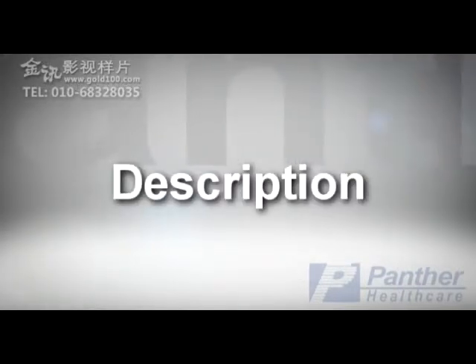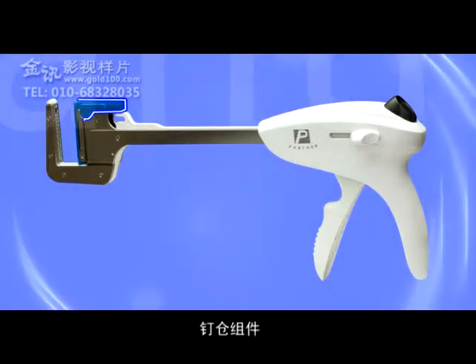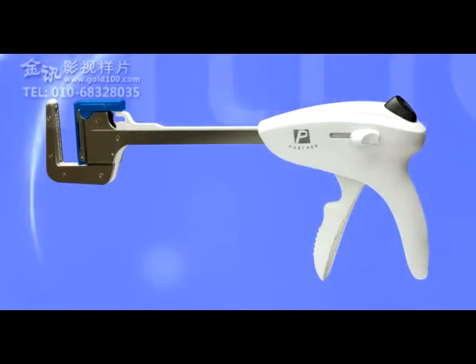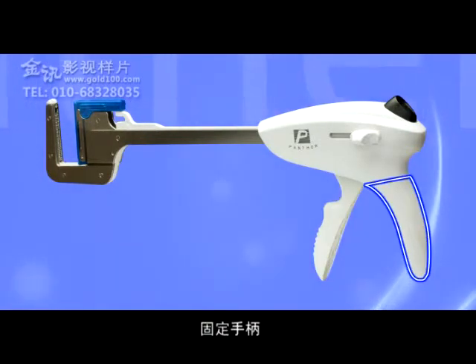Description: Looking at this instrument, begin at the distal end of the PANTHER linear stapler. Here is the anvil and reloading unit. The retaining pin must be seated prior to firing the instrument. The retaining pin knob and the release button are at the back of the instrument together with the fixed and firing handles.